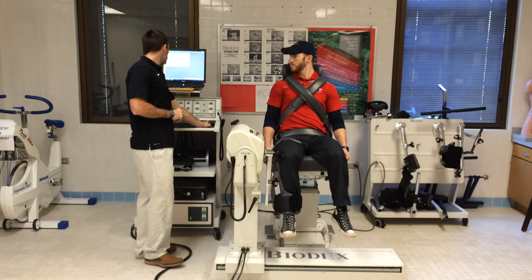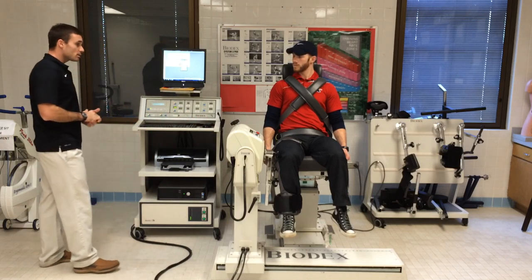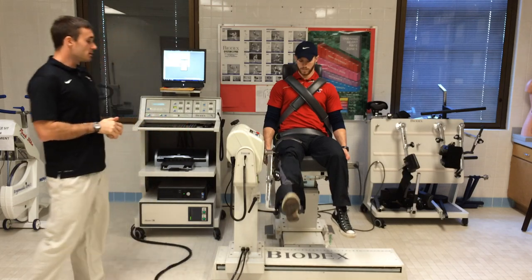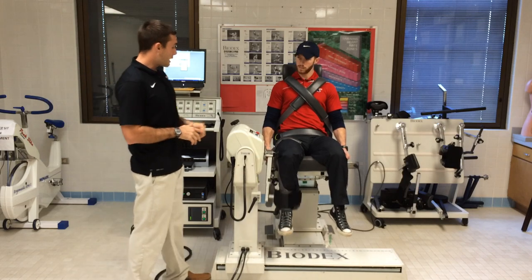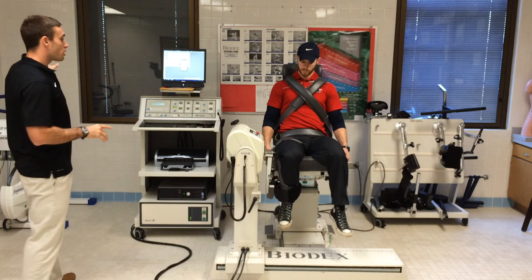So I'm gonna hit the go button here. Bo, what I want you to do is start moving your leg to the range of motion. So that right there, and that give me about 50%. Good, give me 100%. Good, you feel that right there? And then whenever you're ready, I want you to pull the leg all the way back and hold it. That's gonna be our start, hold it.